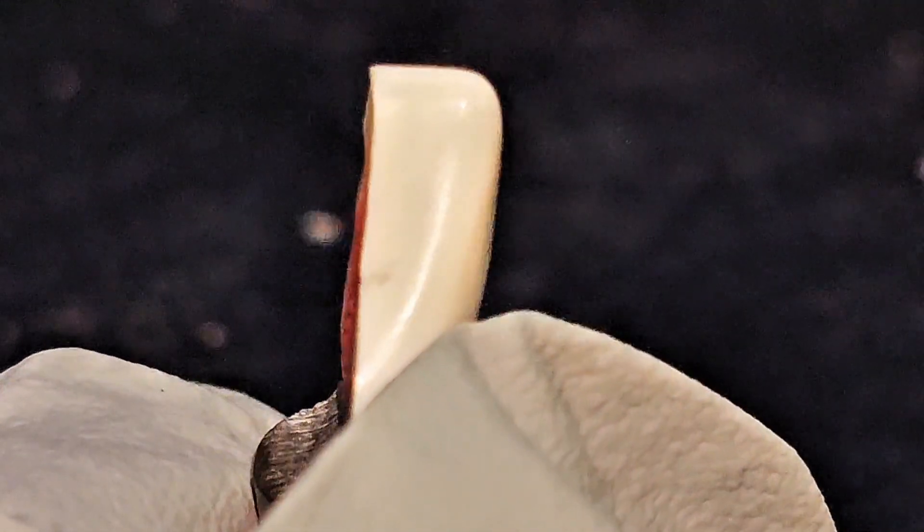See? This area. So it is about 2mm from the bottom of the triangular fossa and about 5mm. Let's go back to the side.